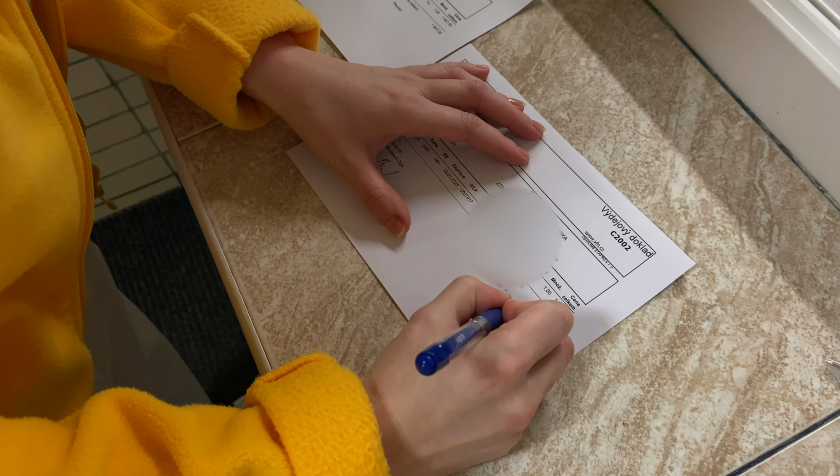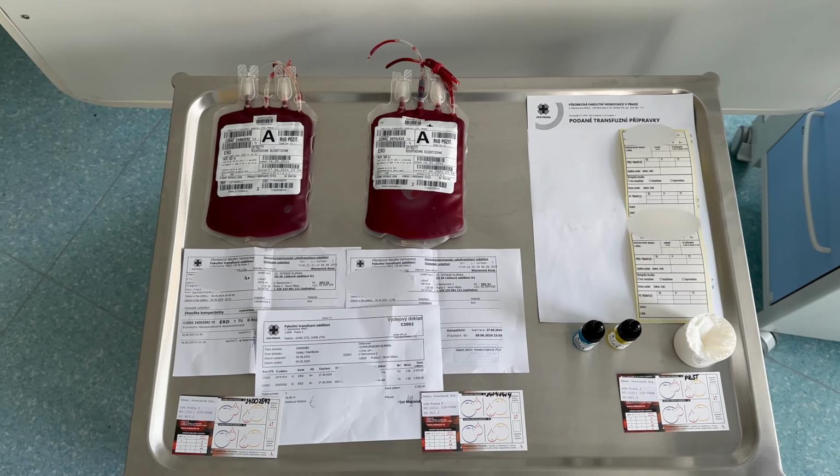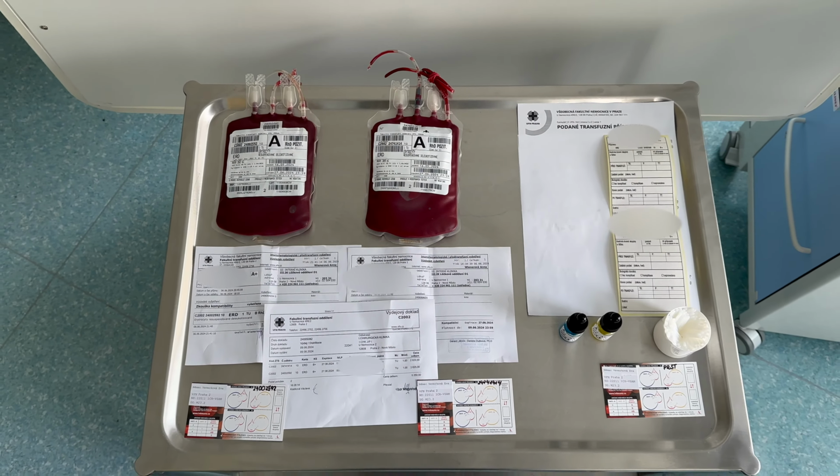Upon arrival at the department, the transfusion product and documentation are checked at the patient's bedside. The physician performs a blood group compatibility check, Sangvi test, using blood from the transfusion product and the recipient. Sangvi test procedure. On a pre-printed Eldon card, 1 drop of blood from the patient's finger and 1 drop from the blood product are placed.